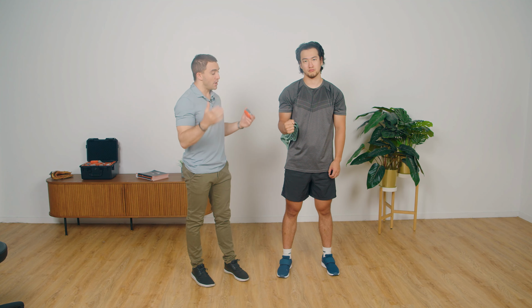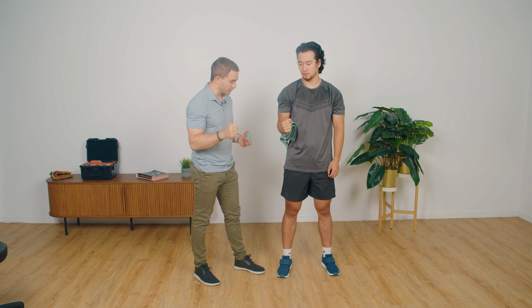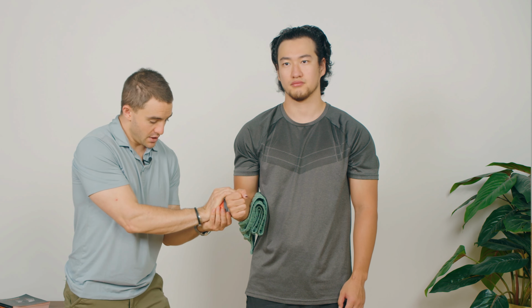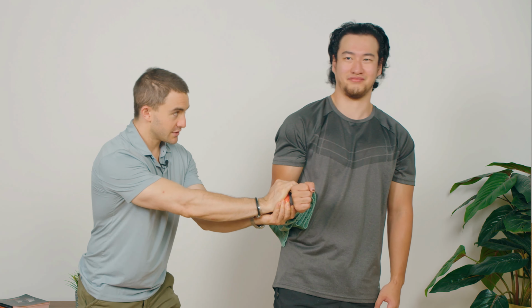Essentially what I'm trying to do is overcome Cal's force, and my instructions to Cal will be, Cal, what I want you to do is hold here and don't let me move you, okay? I'll apply the dynamometer to the body region and I'll say 3, 2, 1, go, and I'm going to try and push until Cal can no longer apply force, at the point at which he breaks.